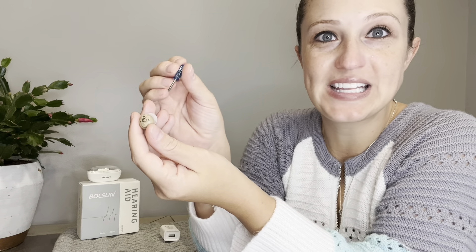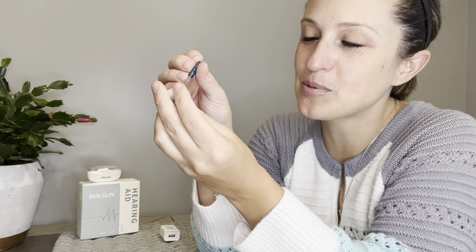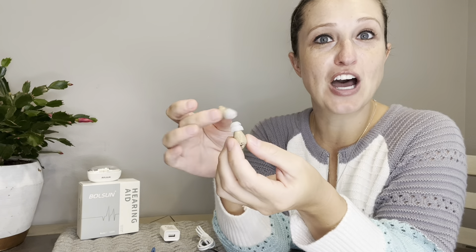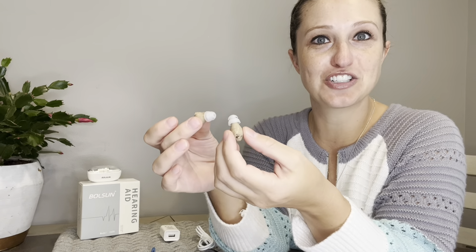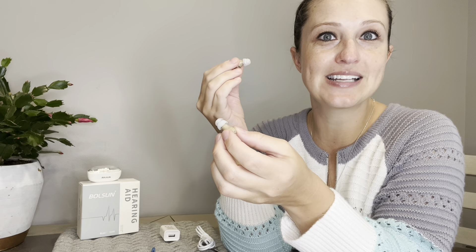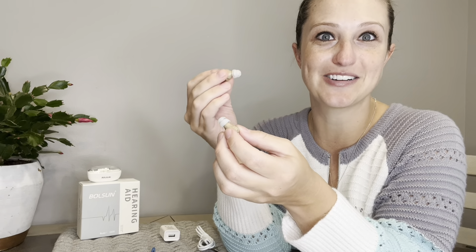Since this is going to be my first time using these, I'm going to turn the volume down a little bit until I can find the proper adjustment for me. A great thing about these hearing aids is they're not right or left specific — they are interchangeable, so you can grab one, simply place it in your ear. You want to place it as deeply as possible, while still being comfortable, so you can get the best hearing possible.